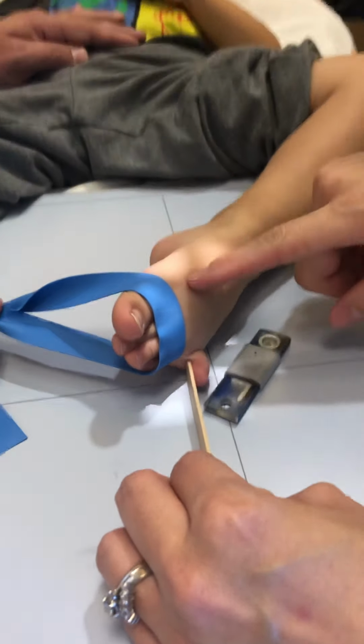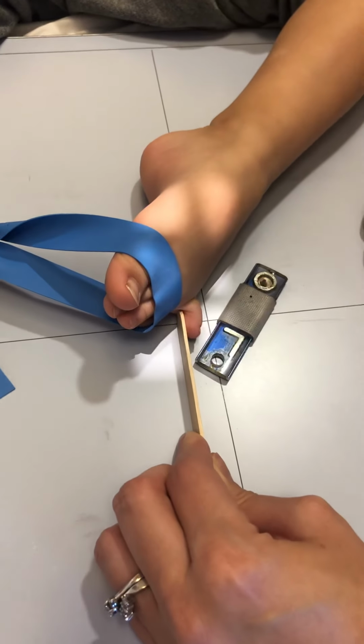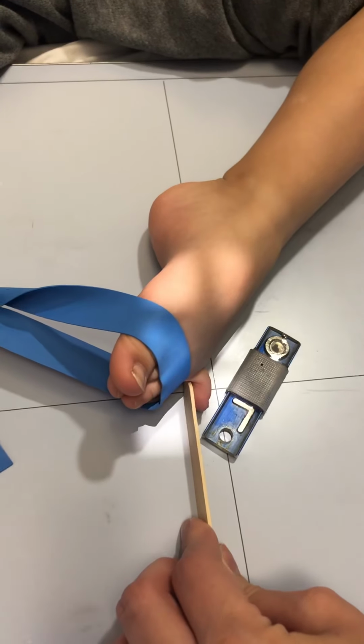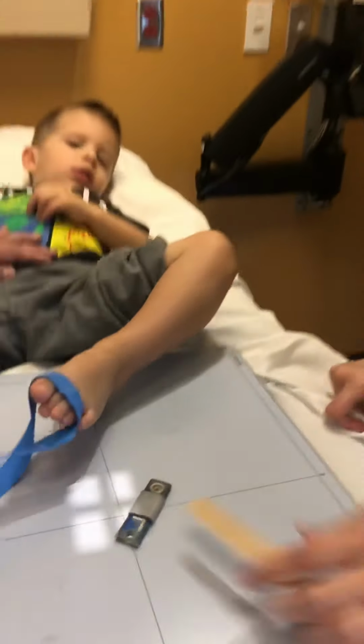Central ray, I have a little farther back just because the toe is so thin. Your penetration won't be adequate, okay? And that's how you do a toe x-ray.